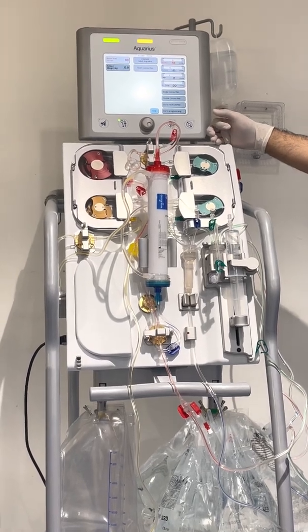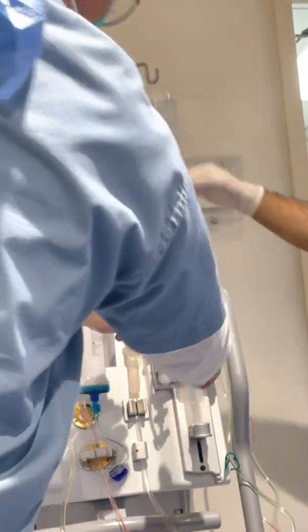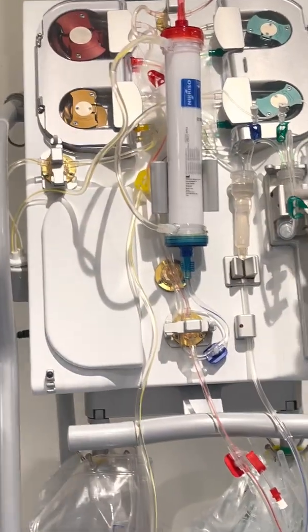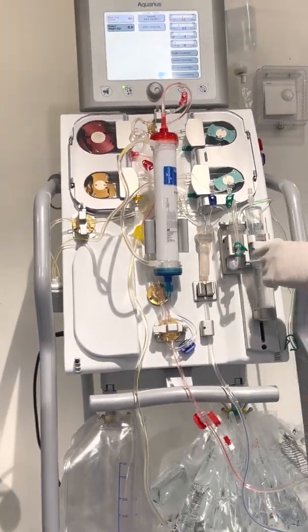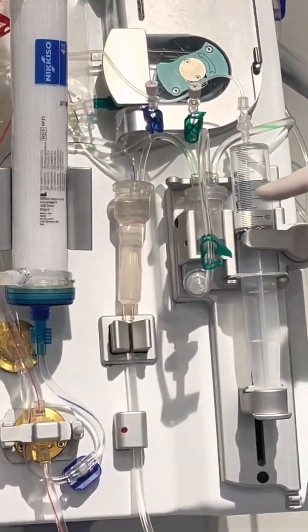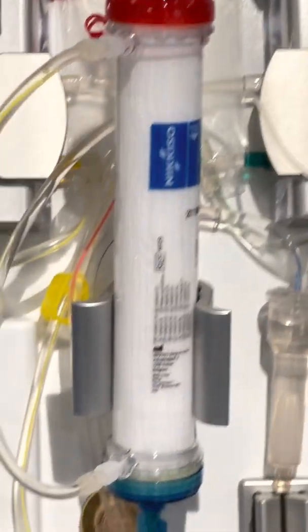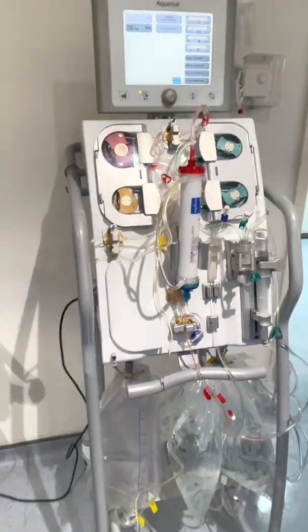So now we're going to set the parameters. No need to unplug or unclamp this. And also, if you see like this, the level of this chamber is like this, you can aspirate to make it full. Where's the syringe here? Anyway, this one is clean. This one is very fine.